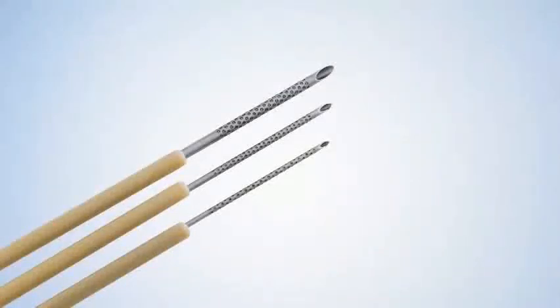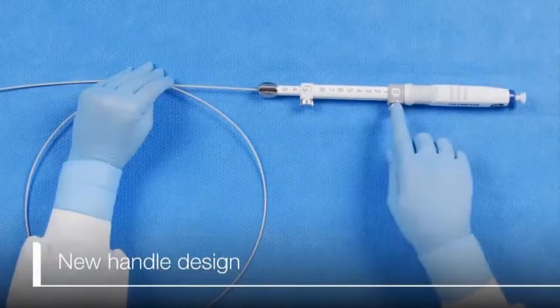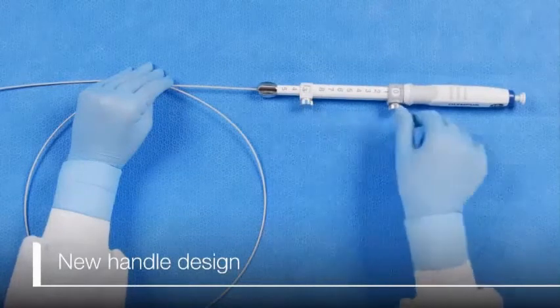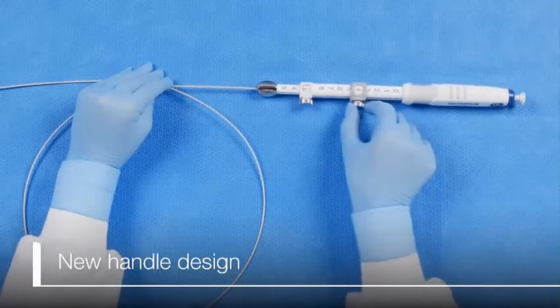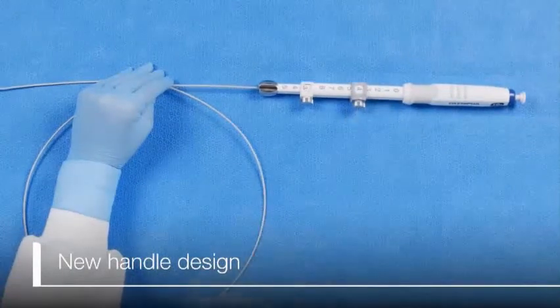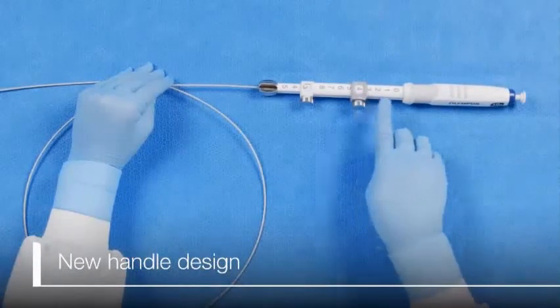Now we will demonstrate the EUS guided liver biopsy technique using a standard EUS needle, which comes in 3 different sizes: 19 gauge, 22 gauge, and 25 gauge. The needle has a needle knob and a sheath knob. For example, when the needle knob is on number 4, the needle will extend 4 centimeters when the needle is pushed down.